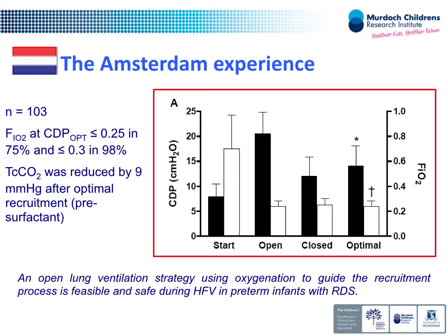How do you know there's no damage to lungs when you're using such high pressures to recruit the lungs? Okay, you're going to talk about lung injury later, right? You can be just as good at damaging the lungs with low pressure. You can be just as good at damaging the lungs with the pressure you think is the right pressure.